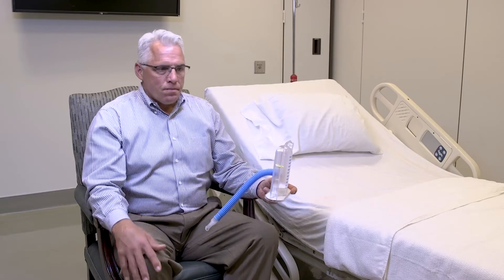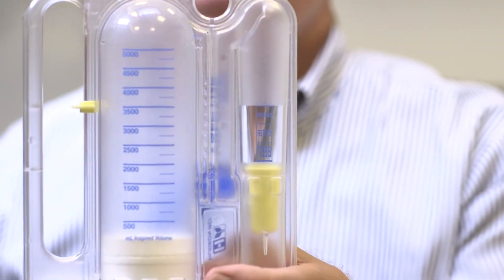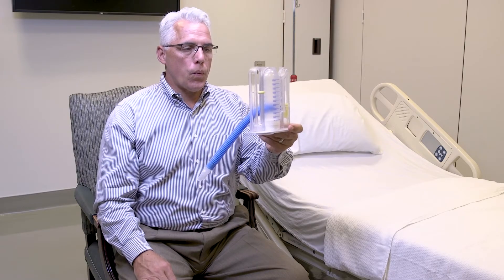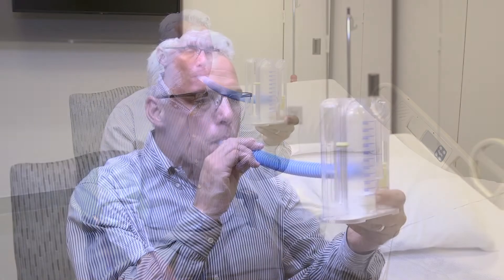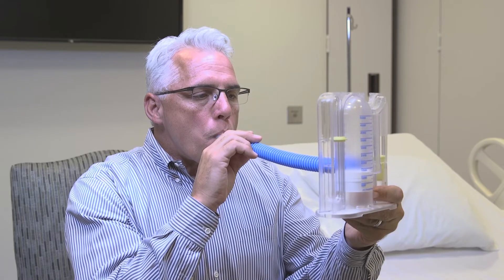To use the IS, sit up as far as you can in the bed or chair. Hold the IS upright at eye level with the flow indicator facing you. Exhale fully before you begin. Place the mouthpiece in your mouth and seal your lips around it tightly. Breathe in slowly and deeply through your mouth to raise the white piston in the main chamber as high as you can.